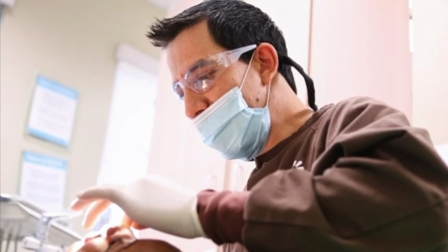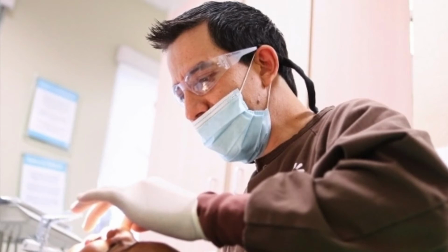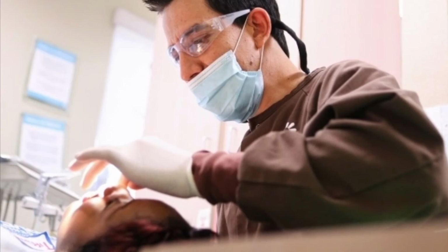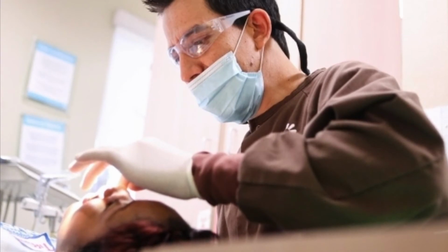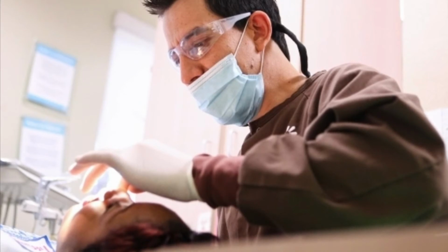I will repeat this procedure for determining the working length. Examine the preoperative radiograph and estimate the length of the tooth. Then know the average length of each tooth and place the file selected to be the correct initial width into the canal, with its rubber stopper set at the estimated working length.